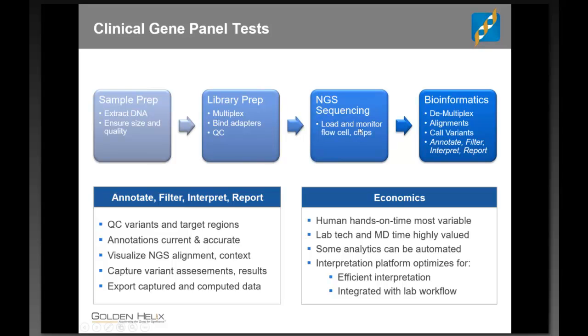And just like any other test, these are well characterized. They have R&D samples or QC samples you can put through them. Get your lab or your targeted panel selected. That allows you to get down to pieces of DNA that are going to be focused on those specific genes or those specific exons of those genes. Then that gets loaded up onto a sequencer, such as a MiSeq from Illumina, or the NextSeq, or from Ion Torrent, you get the PGM and the Proton.